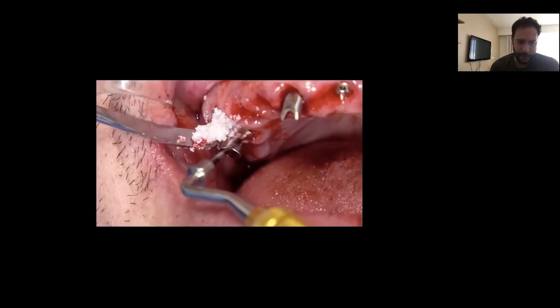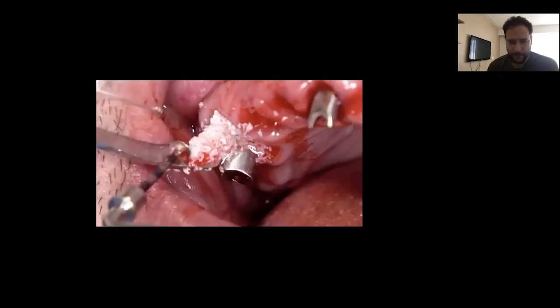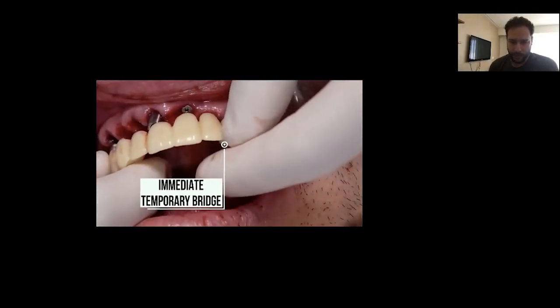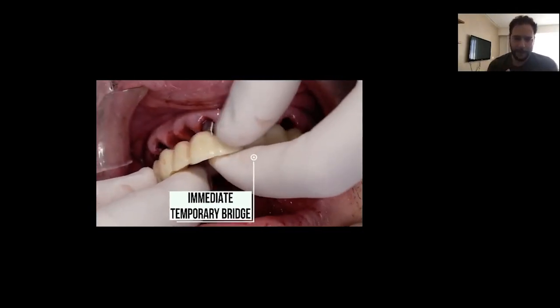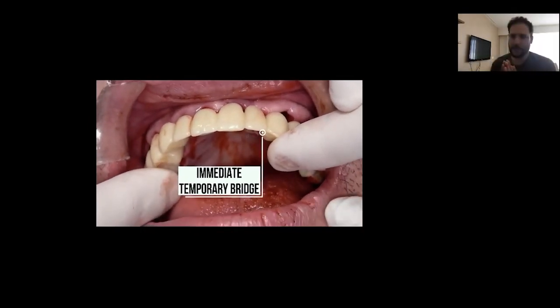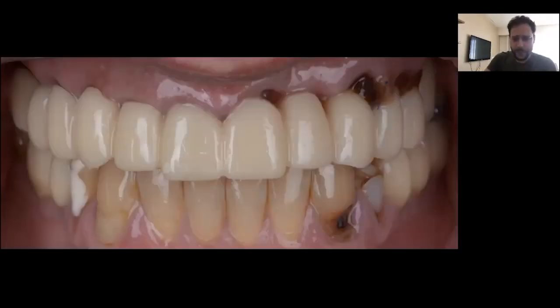These are actually blocks of xenograft with collagen, and we can pack everything very tightly to avoid any soft tissue invagination that would lead to a loss of contour. After surgery, it is very easy to seat the immediate temporary bridge on top of the immediate customized abutments — very easily, very fast. Immediate loading is achieved in just minutes; what would take hours is now almost automatic with this reverse-planned, prefabricated prosthesis.